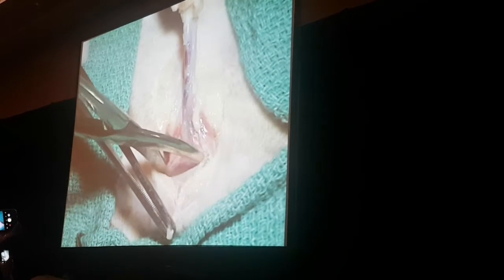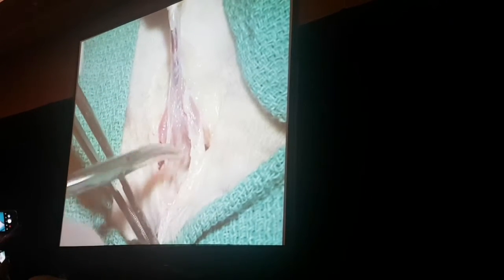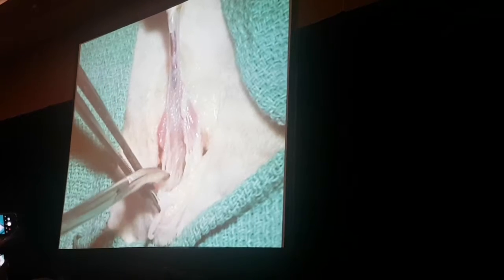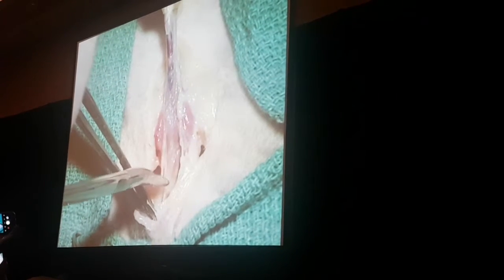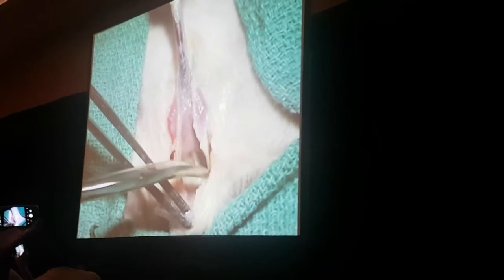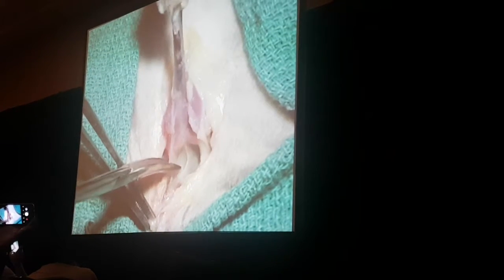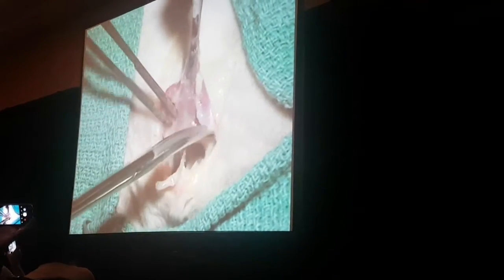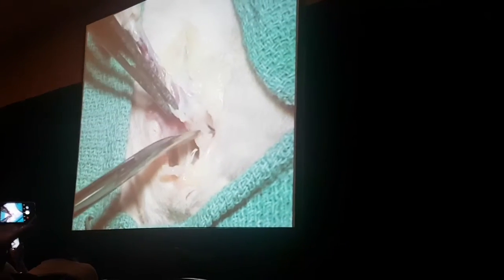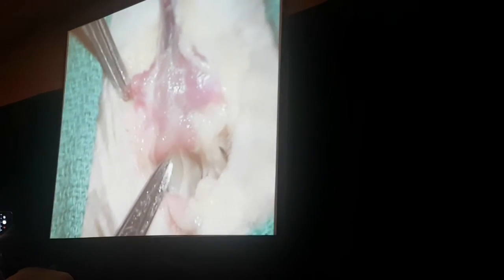Now we're continuing our dorsal dissection. We're going to try to identify his bulbourethral glands. These small strands of connective tissue that are attached need to be dissected carefully off the dorsal aspect of his penis. And then once you begin to see the paired bulbourethral glands, that will identify that you are as proximal as you need to be. You can stop — any further dissection is not going to result in a larger diameter opening in his urethra.